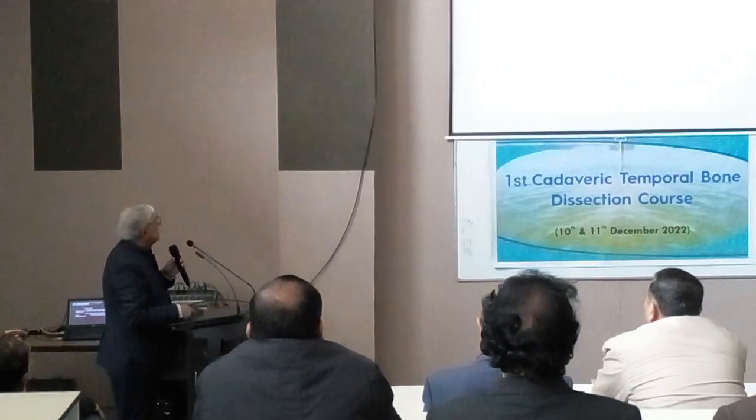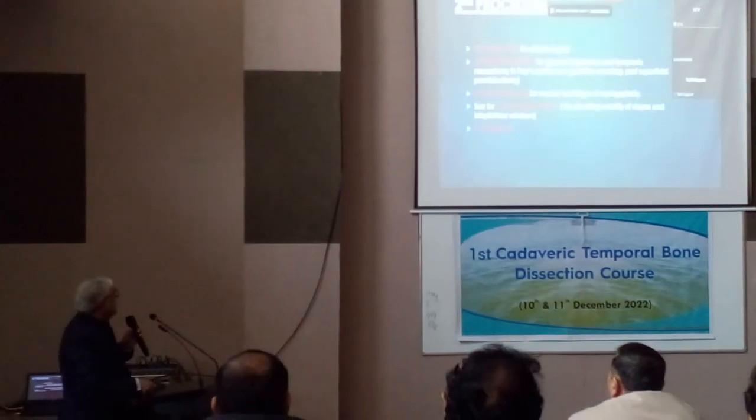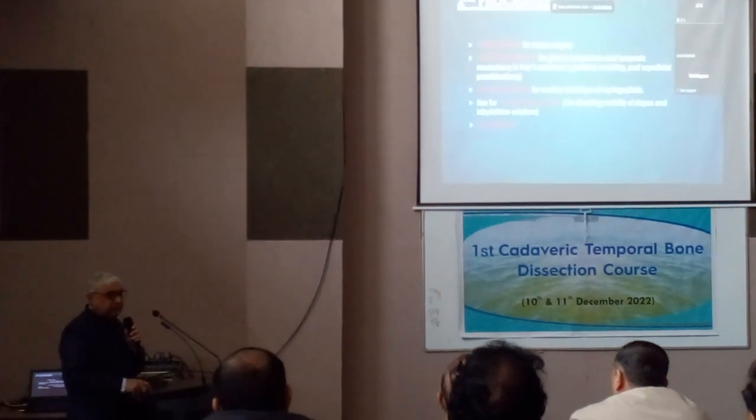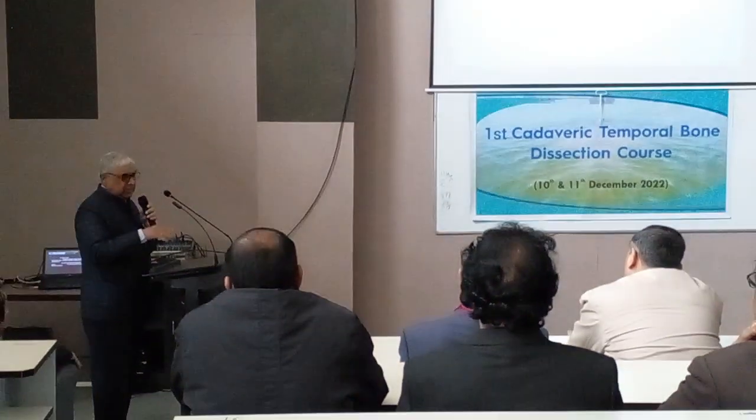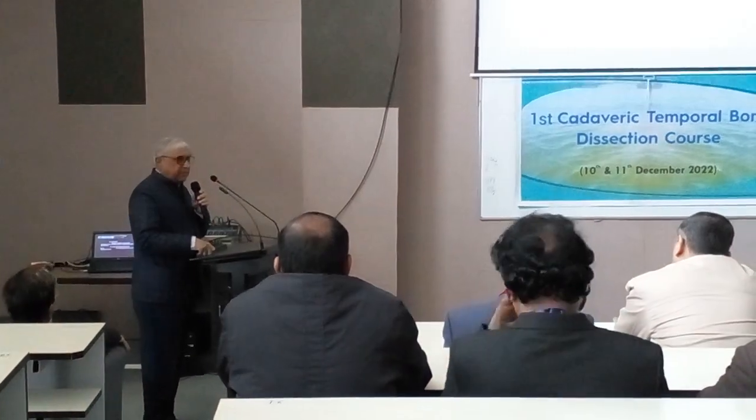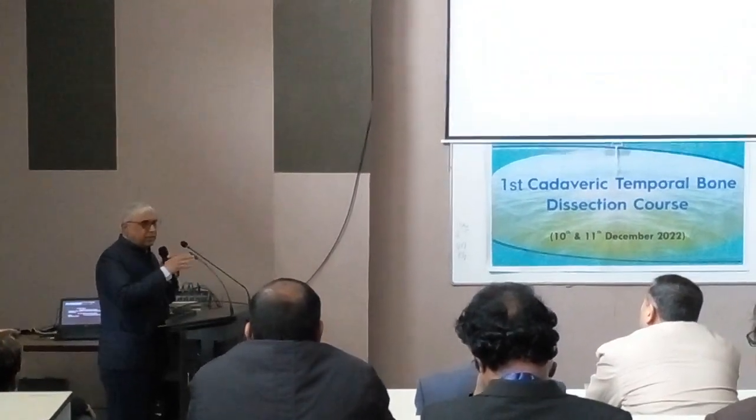Then you can do canalplasty. If you want to widen the external canal, because the external canal is now exposed, you have elevated the canal skin, then you can widen the canal.